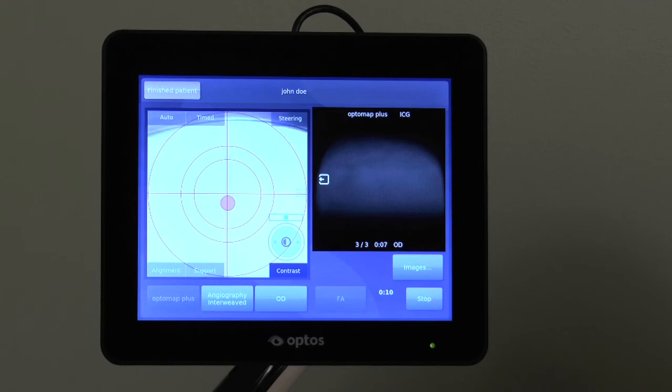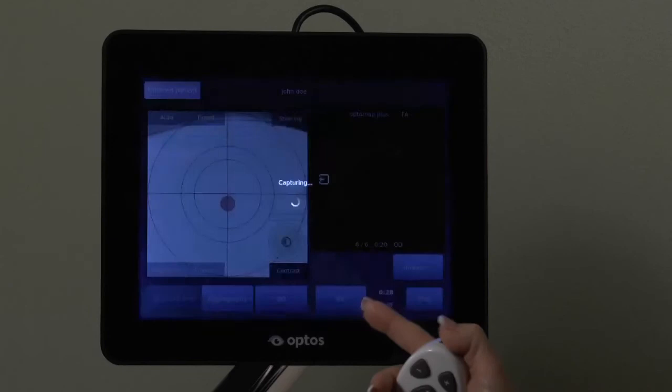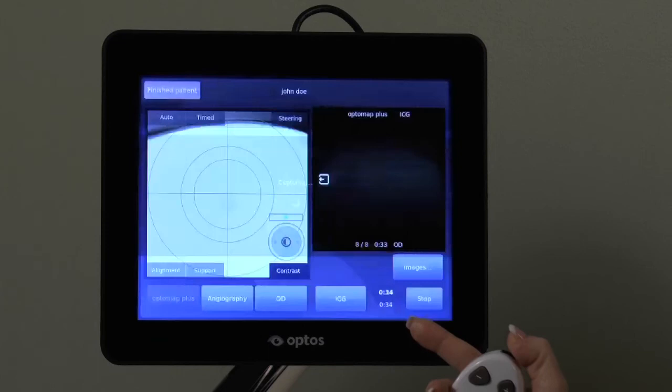You may choose to override the interweave and manually select the desired images to be captured at any time during the session by switching to the Angiography procedure and choosing the desired image to be captured. You will then see two timers displayed and have the ability to manually switch back and forth between the two imaging modalities based on your specific protocol.